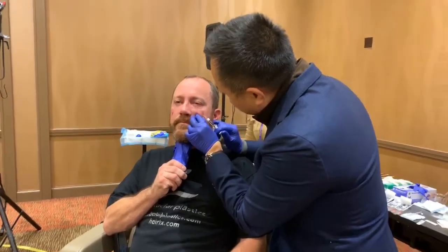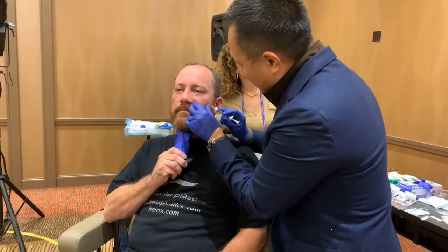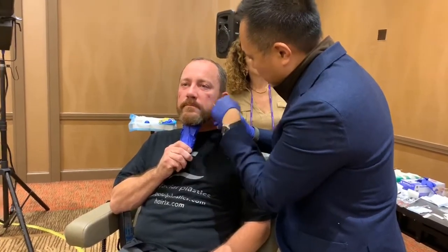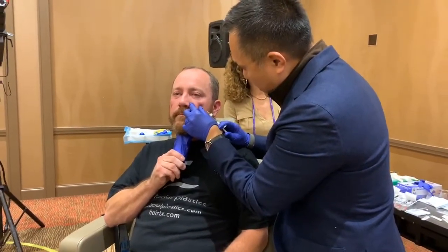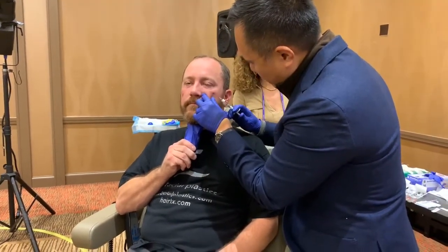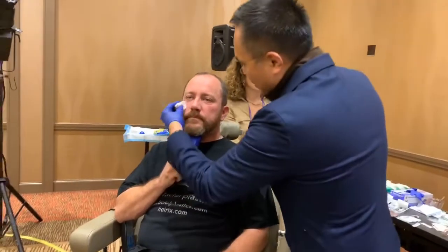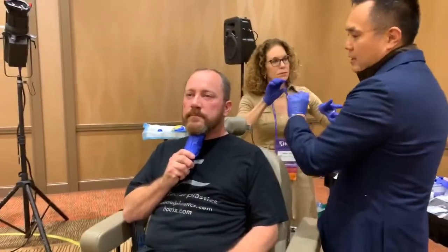I'm just slowly putting it in, reassessing as I go. If a patient has a lot of other deficits and only a budget of a couple of syringes, I have to really think about where I'm going. Billy has relatively deep-set tear troughs — he's a gentleman and doesn't necessarily need his temples or sub-malar area filled to look better or more rested. My focus really is to get this tear trough area looking great. It's similar to remodeling a home: you fix the kitchen and suddenly the bathroom looks horrible. Fortunately Billy's other facial areas aren't bad, so we're focusing on the kitchen here.